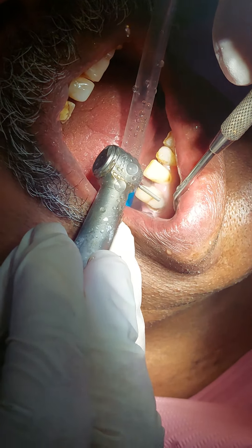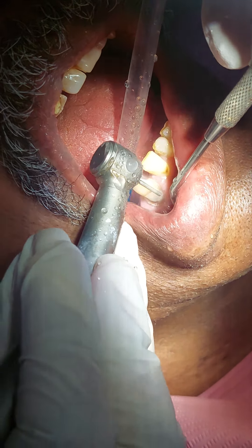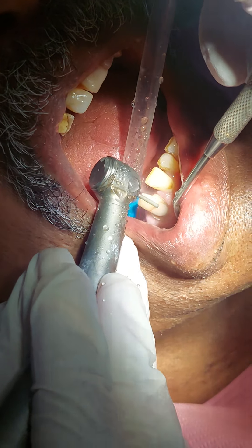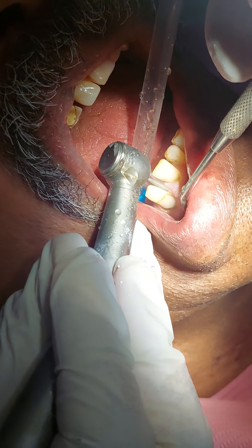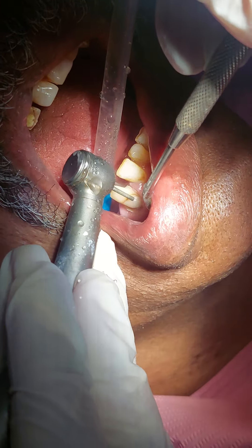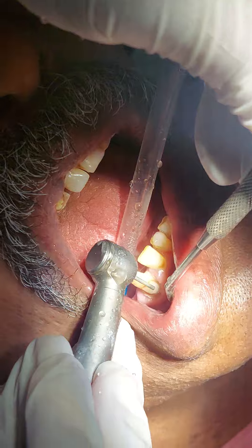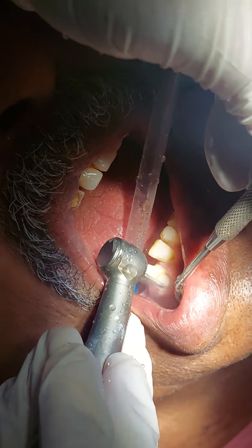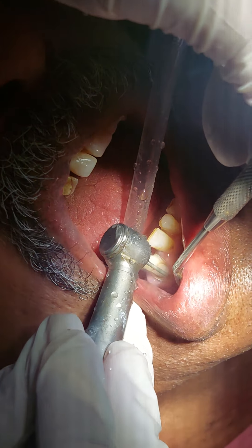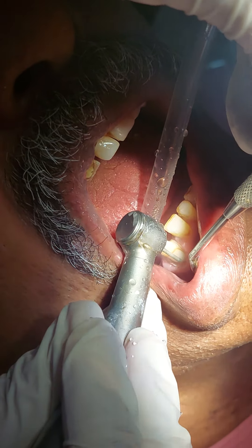Notice my orientation of the bur — the head is over the center of the tooth. I'm not working yet. Now I'm touching — which part is touching from your angle of view? The part touching is the middle of the bur. So I'm removing the bulge over the undercut, running from here with the correct taper down here. You can even see the scratch marks. Some people would mark it with a pencil. The undercut is here, so I'm going to touch the tooth — which part is working now? It's working on this bulge.